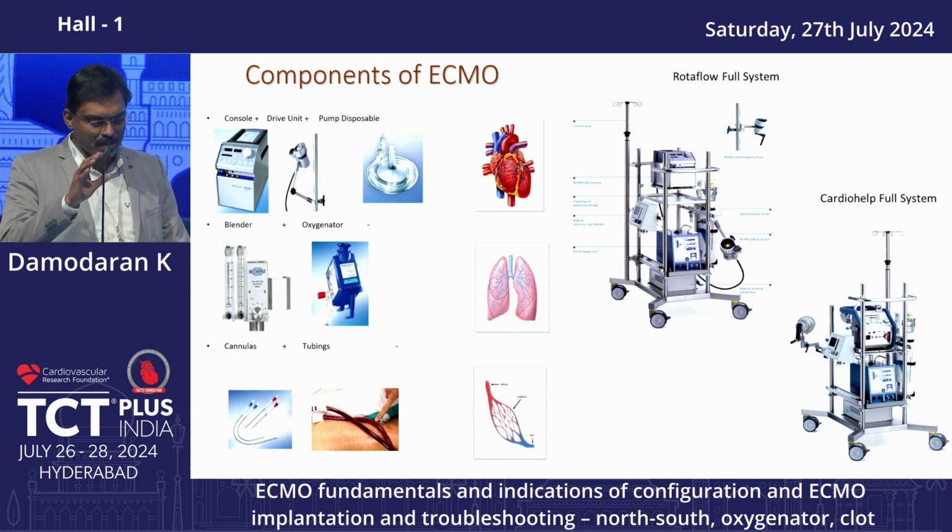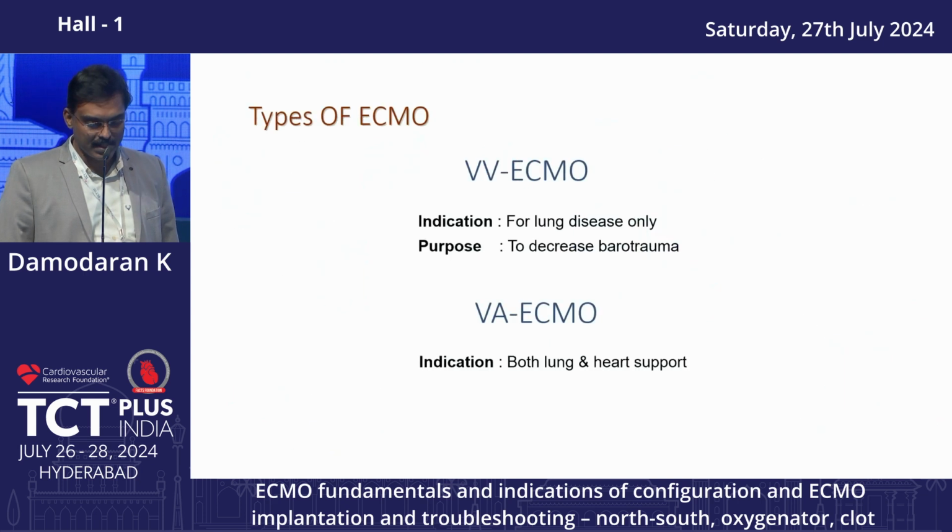In the past, most of the studies in ECMO were registries, and the technique of cannulation was not like the contemporary large bore access devices, about which we cardiologists have a lot of knowledge after TAVR and structural programs. We can do this with the help of ultrasound guided large bore access, which can minimize complications. The only downside of ECMO in the past was limb ischemia, which can be very well tackled with contemporary large bore access devices and techniques.